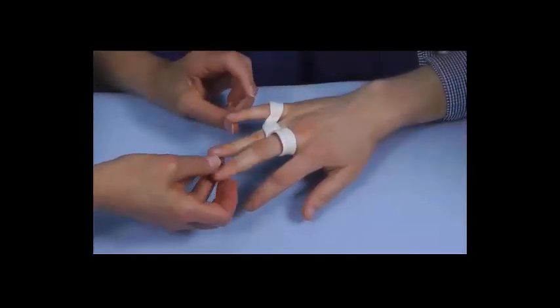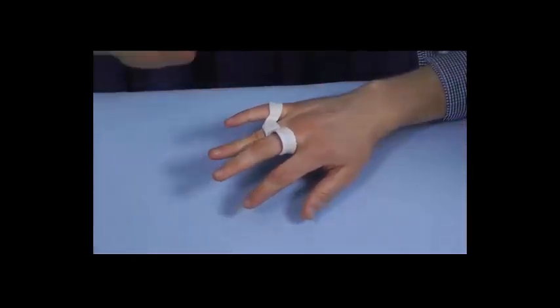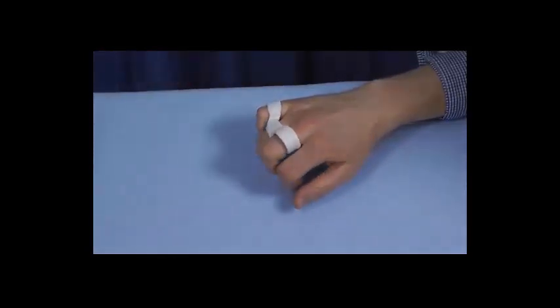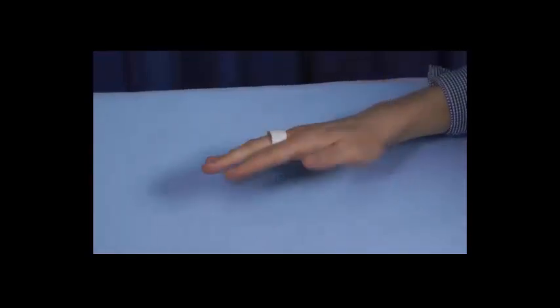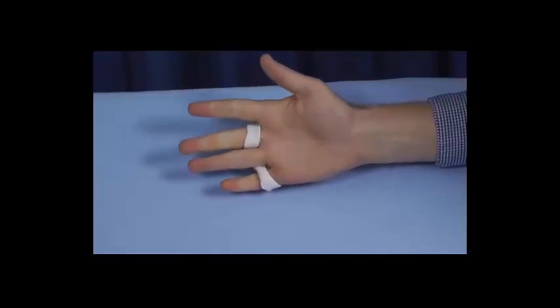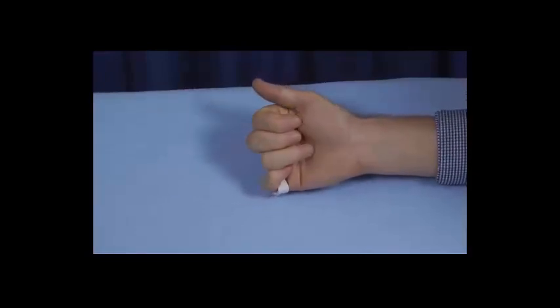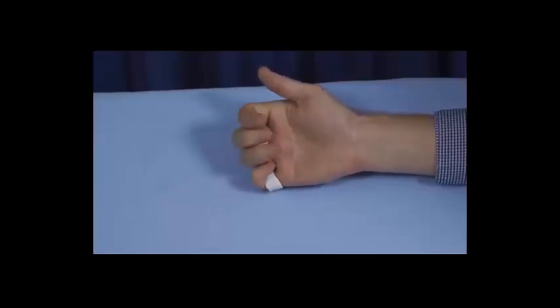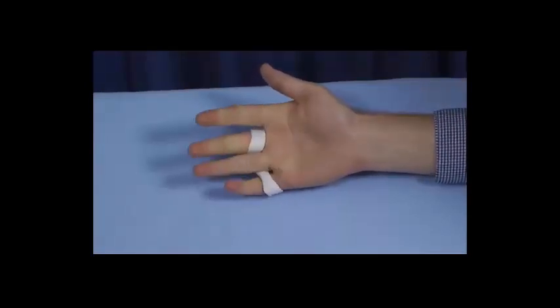Now it's cool. Let's be sure that he can fully extend and fully flex, and the PIP joint flexion is not impeded. Let's take a look at the palm to make sure — and indeed, PIP flexion is not limited. You will notice that MP flexion of the little finger is somewhat limited, and that's not unusual in order to adequately block the ring finger.